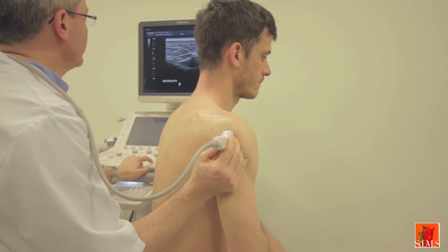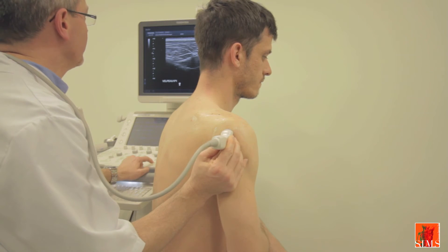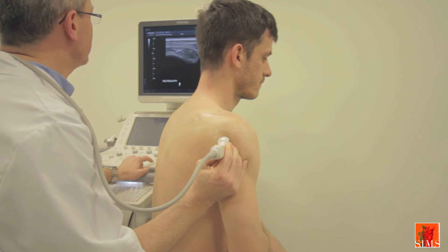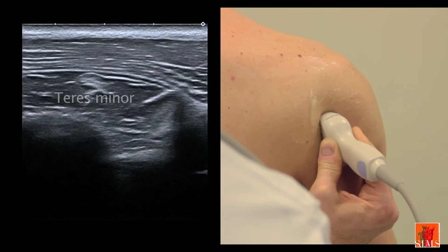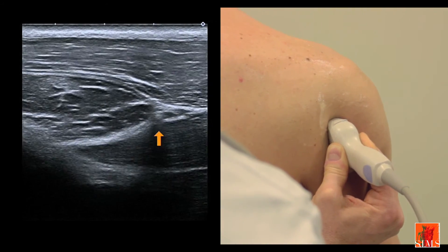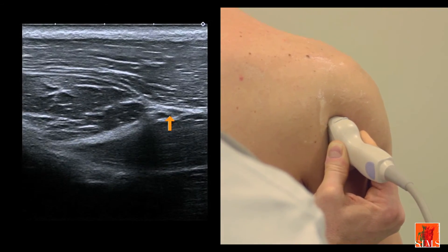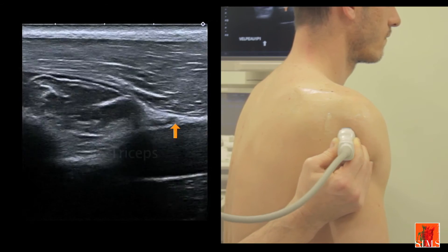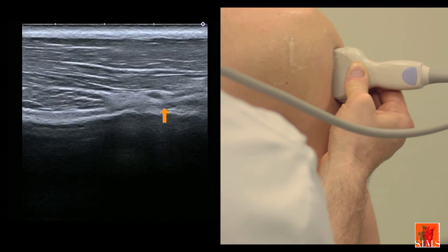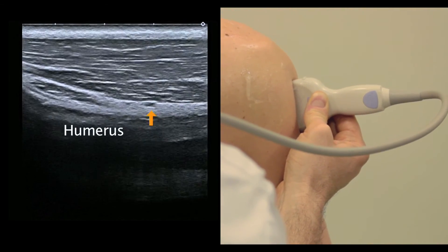We will now attempt to evidence the axillary nerve at the level of the quadrilateral space of Velpeau. In order to do this, we locate the teres minor, as on the previous images. On the immediately inferior part of the teres minor, which forms the roof of the quadrilateral space, we individualize a neurovascular pedicle. With the triceps deep to it, all we need to do is turn around that pedicle to see it circle the diaphysis of the humerus. Here is the small artery, and here probably is the small nerve.